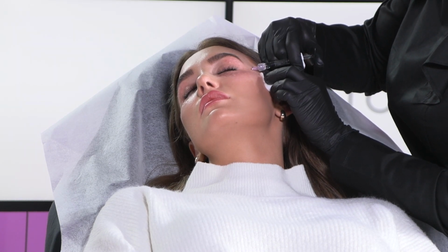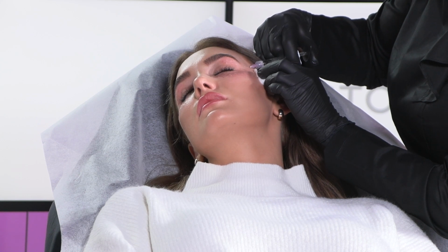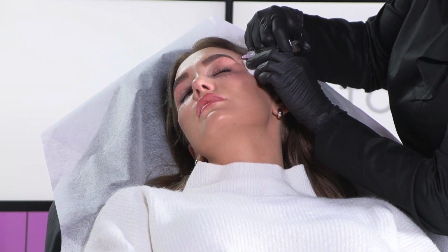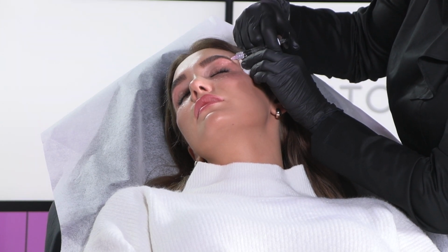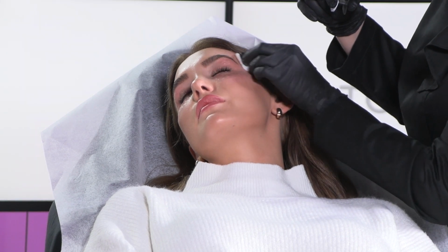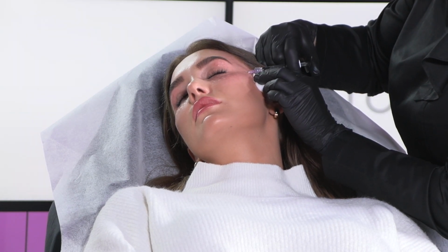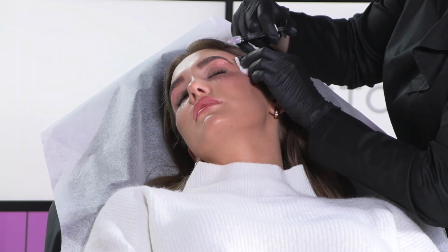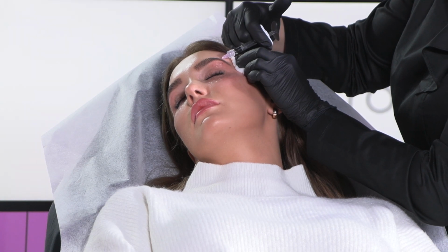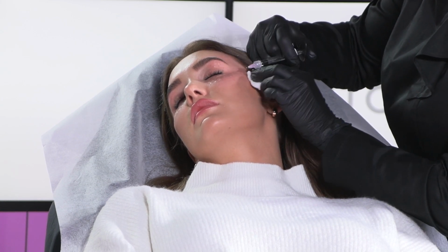After I injected around the eye, I start to inject the temple. So everything that is left, you can spread on the temple area. And also, this is not mesotherapy, but you don't want to lose the product. With mesotherapy, we lose a lot. You can pull the product, and then when you take your finger out, you just wait a bit. So hold on in the skin, and you will leave everything in the skin, the last drop. We lose a bit, of course, but it helps.